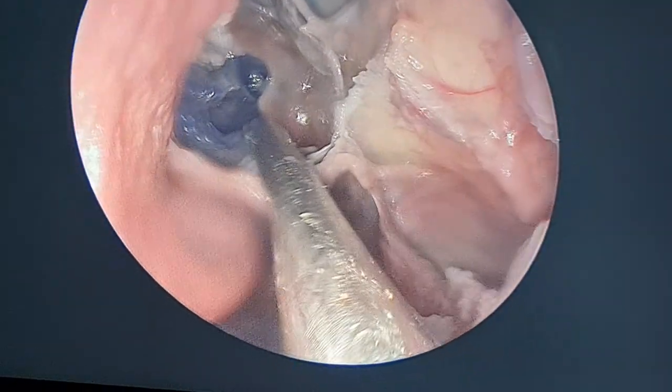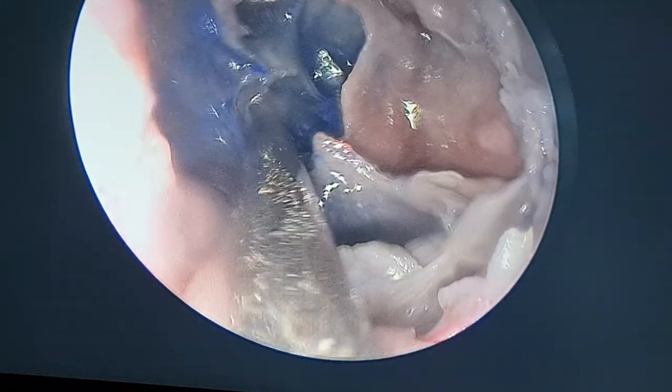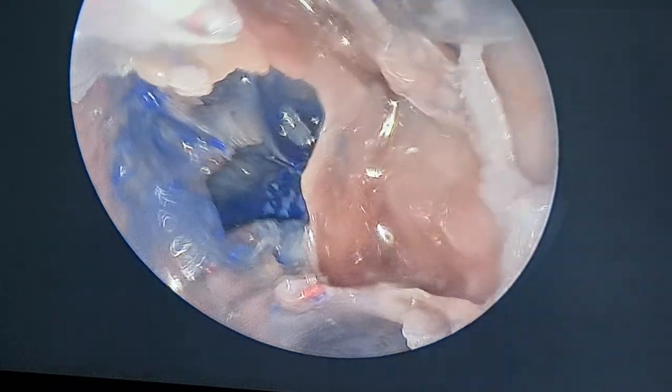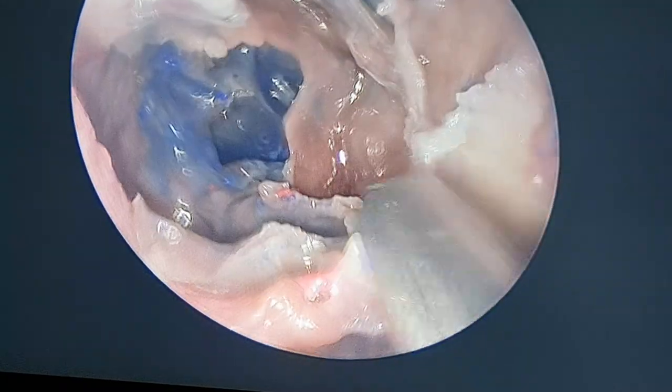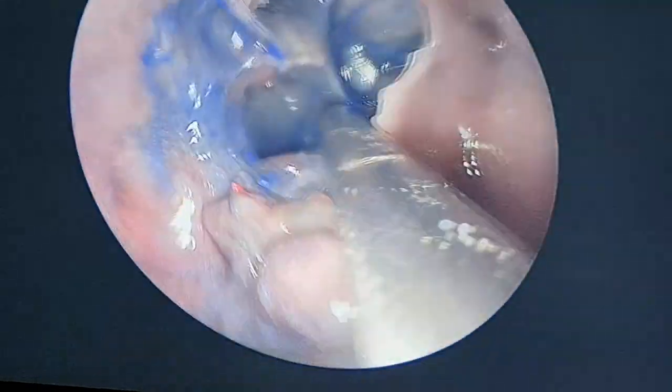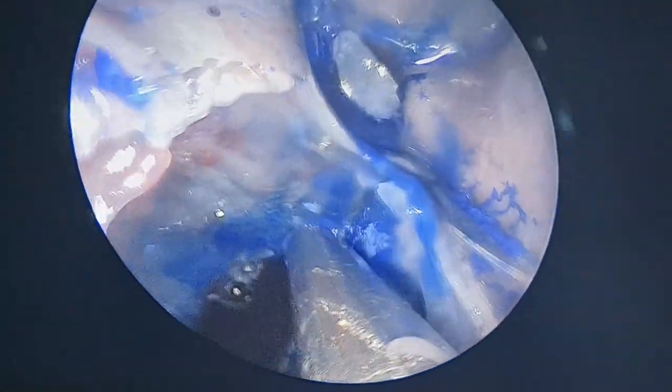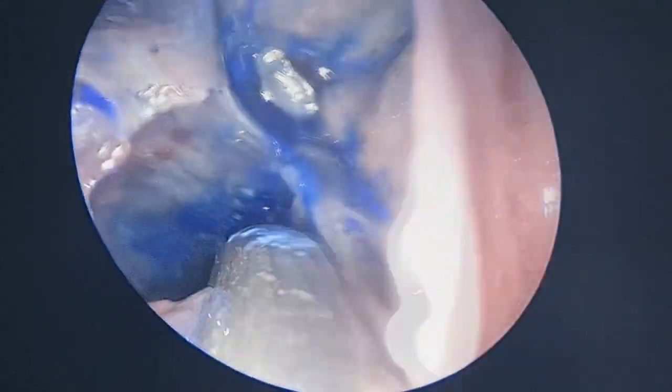Open the posterior ethmoid ground lamella, stay in the medial trajectory, see the ostium, and then finish the entire posterior ethmoidectomy anteriorly, staying anterior to the ostium, and then widen the ostium. Widen the ostium to look into the sphenoid sinus. That is the interior of the sphenoid sinus. See that?